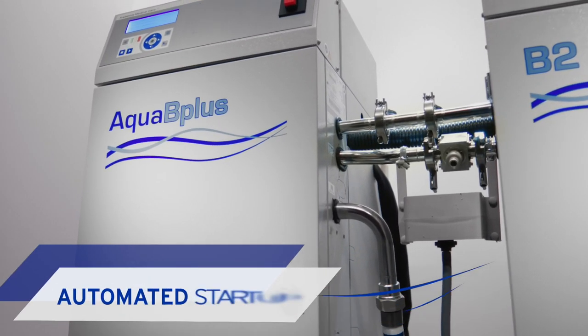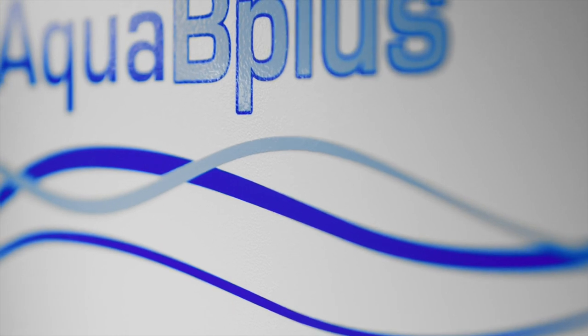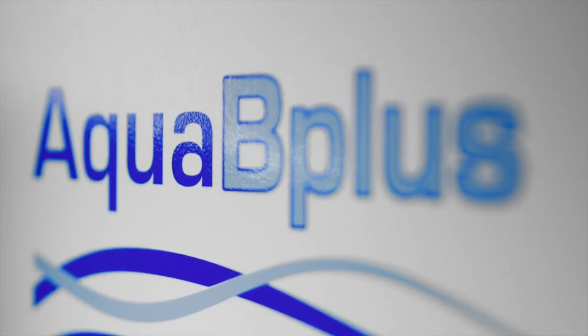Automated self-tests at startup enable seamless operation throughout the day, and emergency mode ensures uninterrupted water supply in case of system failure.